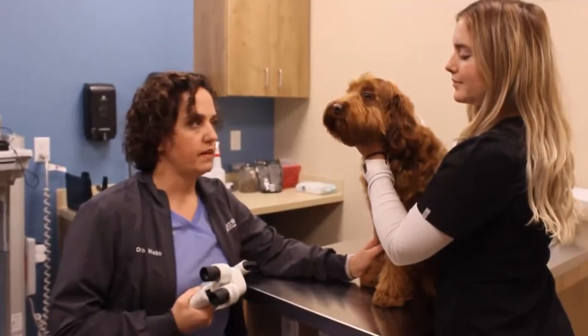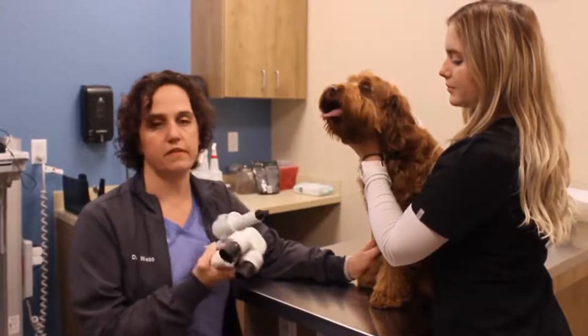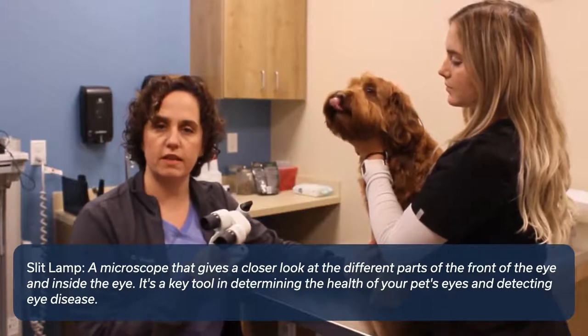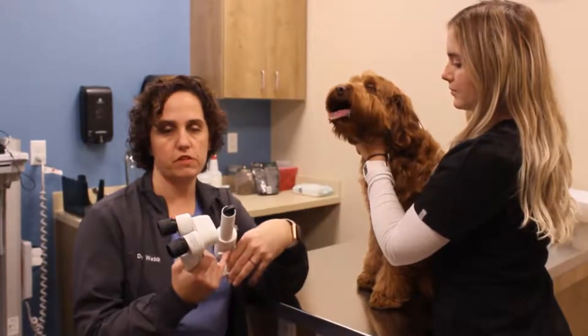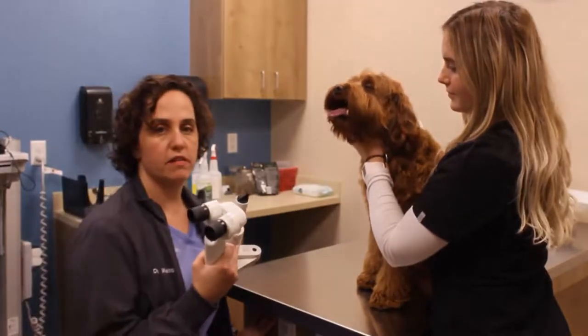Now we're going to do a detailed eye exam where we're going to start with this instrument called a slit lamp. What this does is allows me to look at the eye in sections, similar to when you're at the eye doctor and you put your head in the chin rest and they come forward with the equipment in front of your face. It's very much the same instrument — this is just portable. We're going to turn the lights down a little bit.